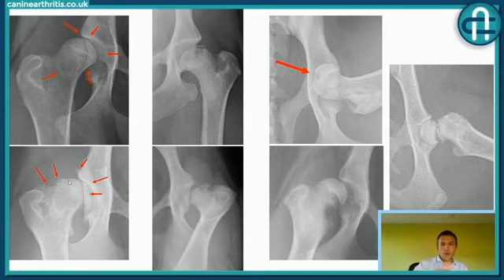So there is a remodeling of the shape, which went from a nice round shape to a kind of mushroom shape with filling of bone at different levels of the bone. That's what we call remodeling. For the acetabulum, the socket part, here the socket is now filled by bone, and that's something that will develop with time in dogs affected by osteoarthritis, depending on the severity of the radiological signs.